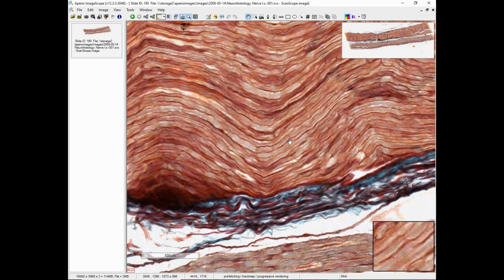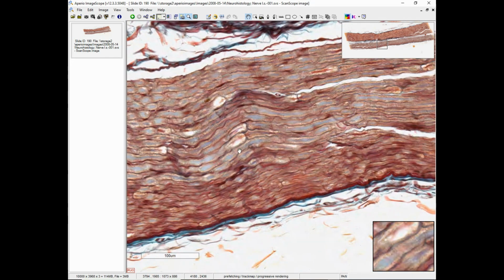But what we do see is the outline and cell boundaries around those individual myelin-producing Schwann cells. So here we can see the axon moving from one Schwann cell, boom, to another. And the myelin sheath for one stops here and another picks up right there. So this is where two Schwann cells meet, and that meeting point is known as a node of Ranvier. And that node of Ranvier is where a lot of surface proteins are clustered that will allow what's referred to as jumping or saltatory conduction of the action potential down this peripheral nerve.